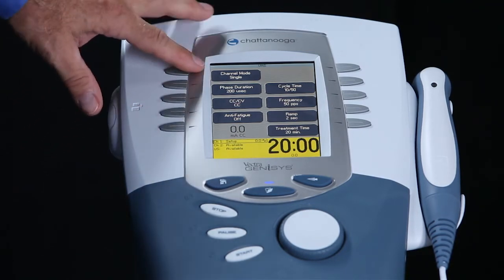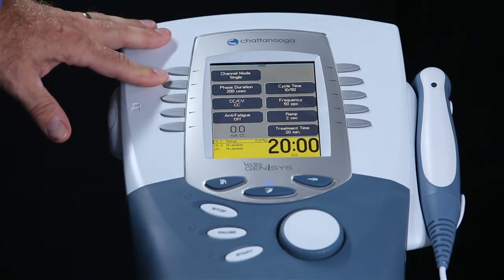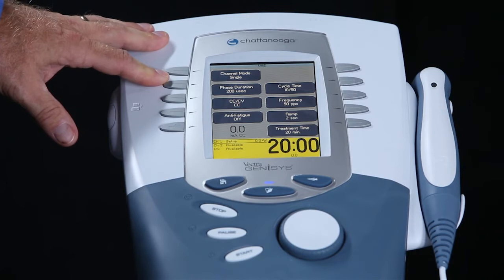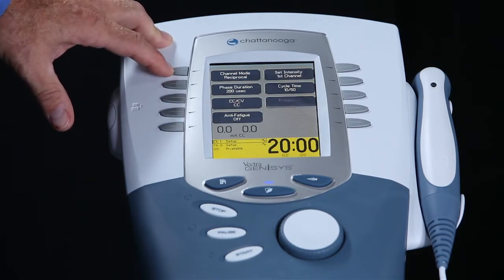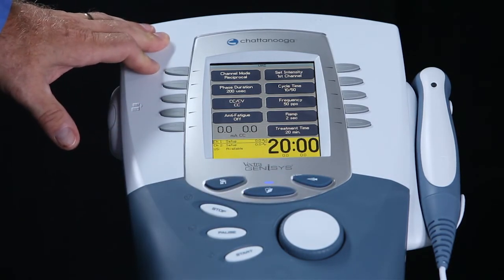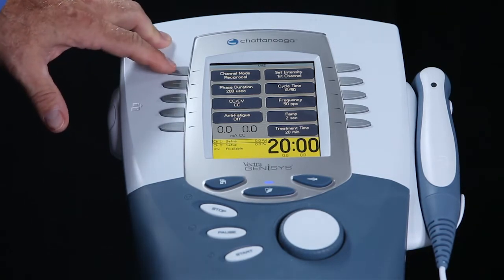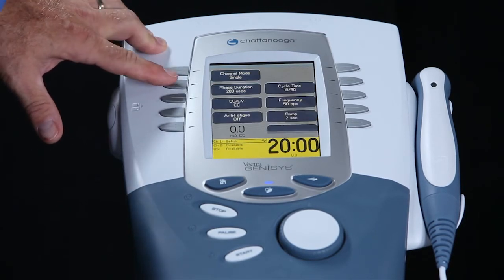You will note that the first parameter to adjust is the channel mode. It's set to single. That means we're going to use one channel and one set of electrodes on one muscle group. Should we wish to do two muscle groups, we can change the unit to reciprocal. We could place a second channel on her hamstrings. We could then contract the quadriceps, the hamstrings, and then have a rest period. For today's purposes, we're going to go with the channel mode of single.